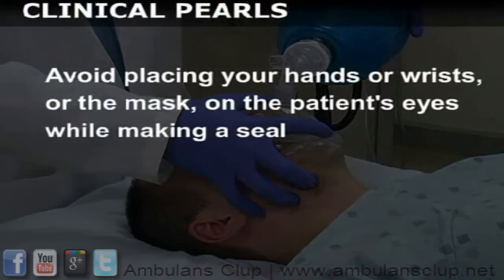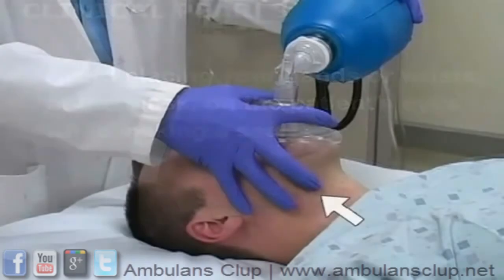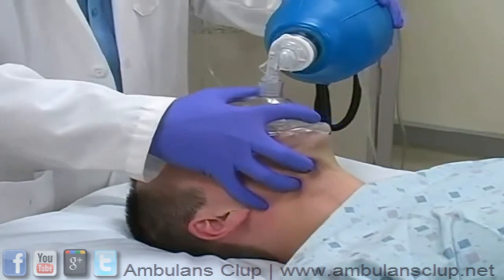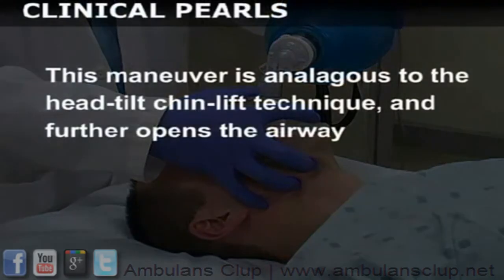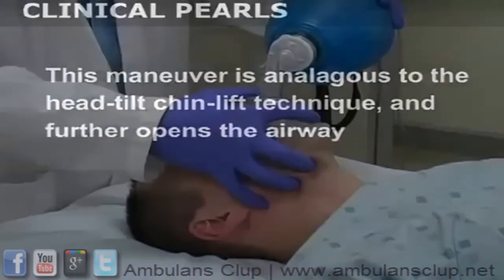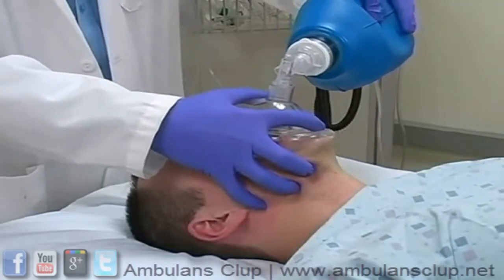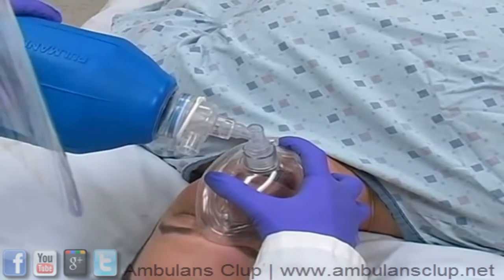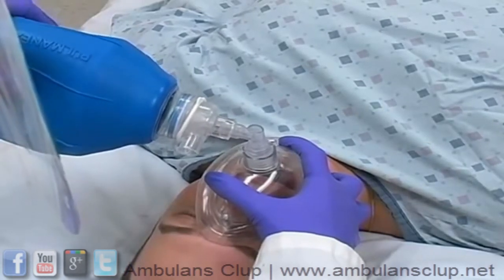Avoid placing your hands or wrists or the mask cushion on the patient's eyes while making a seal. Doing so may cause a vagal reaction or ocular injury. Place your middle, ring, and little fingers along the underside of the patient's mandible and pull it upwards into the mask. This maneuver is analogous to the head tilt chin lift technique, and it further opens the airway. While these fingers maintain upward traction on the mandible, the thumb and index finger hold the mask tightly to the face and ensure a proper mask seal.